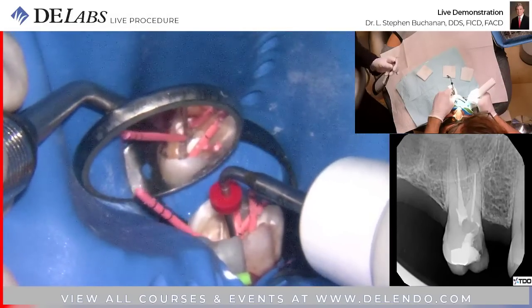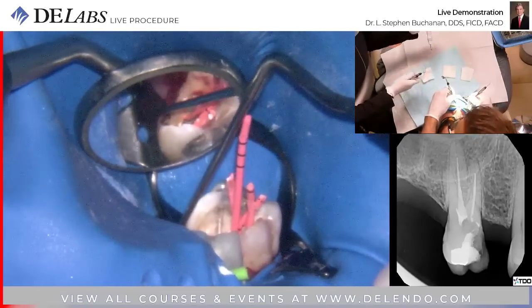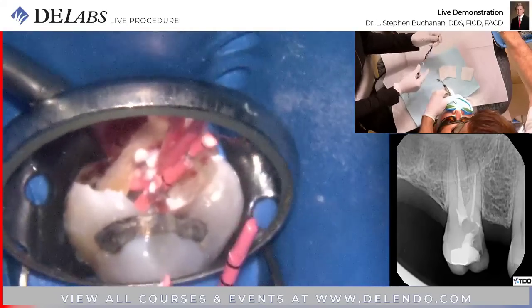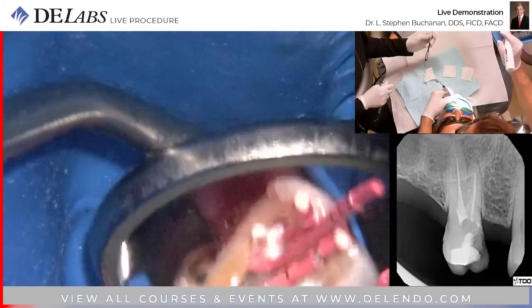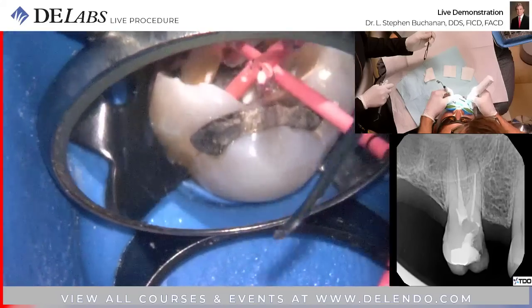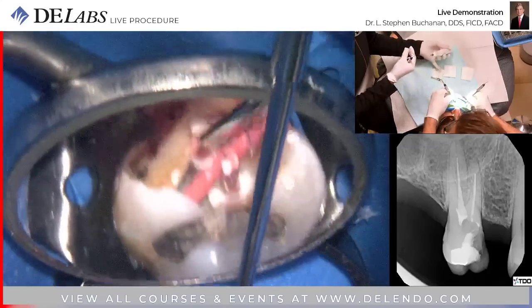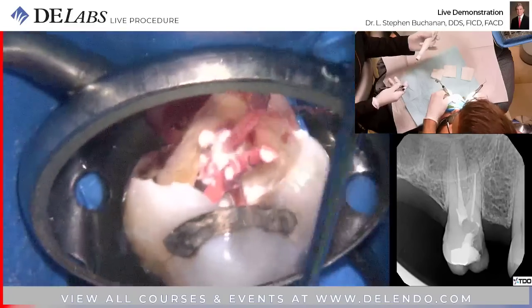Okay, searing off the MB2 cone. Okay, the end of this is 0.7 millimeters.